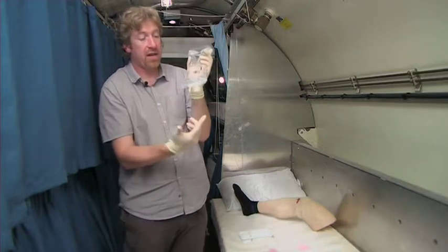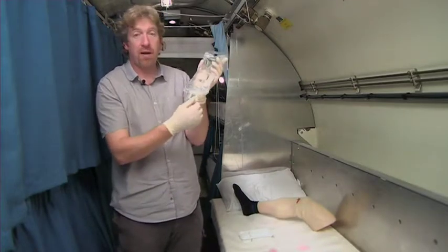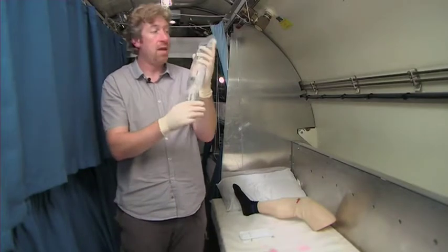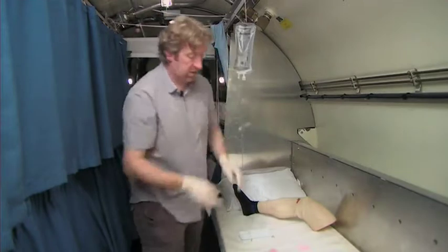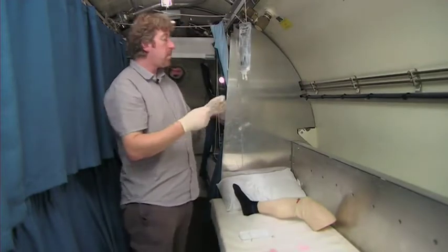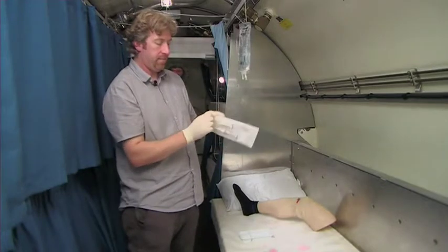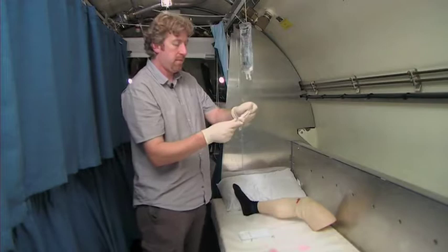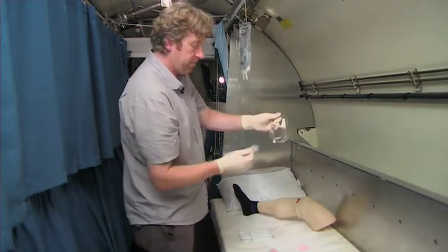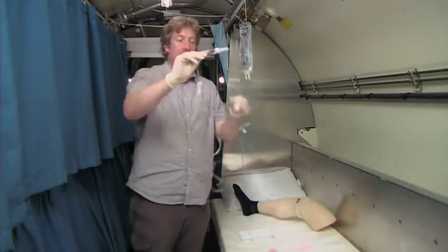One is an injection port that you can inject medication into, and the other port is where we stick the giving set in. So first things first, once you've checked everything and there's no crystallisation, we hang it up, get our giving set, open that out of the packaging, remove the sleeve, and open it up as such.